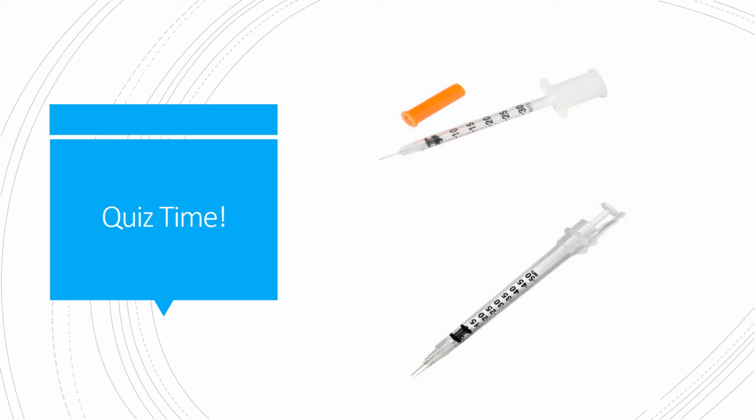So here's your next quiz. Which syringe is able to measure half units? Hopefully you said the top one, because that's the 30-unit syringe, and again, remember, it is able to measure half units of insulin.